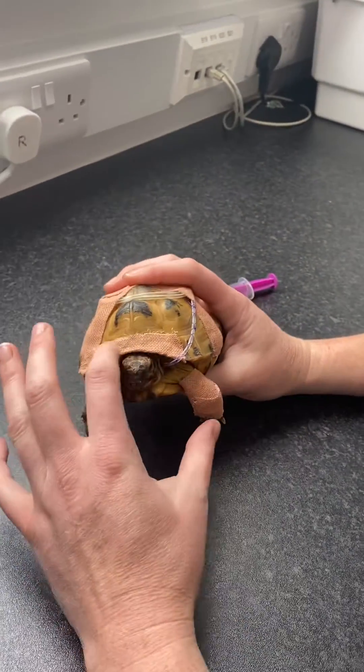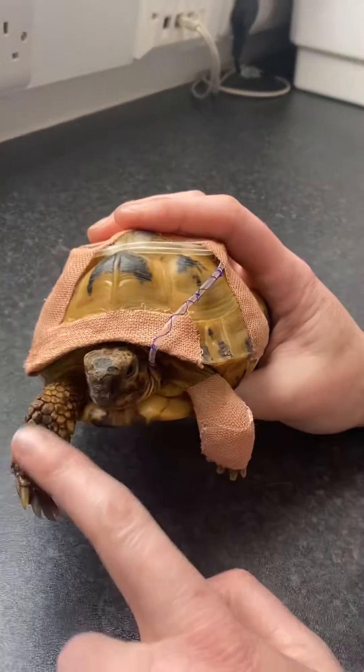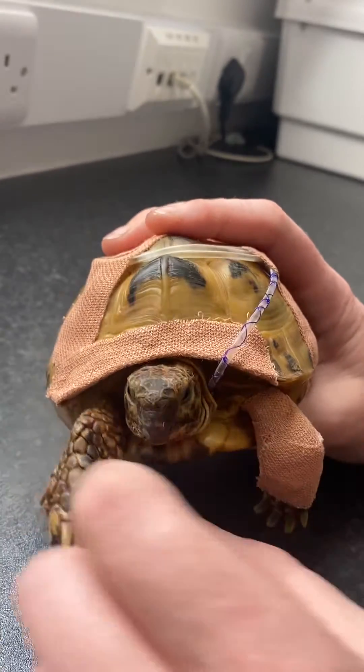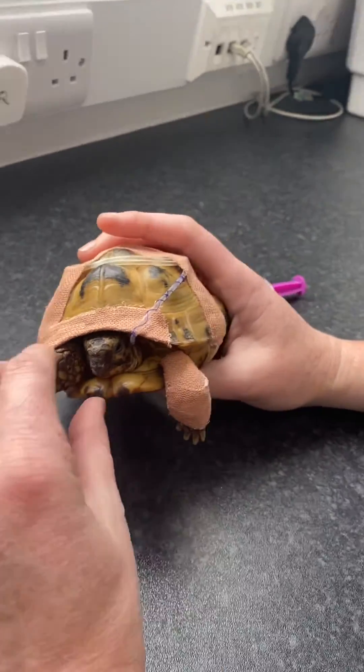We've protected the tube against the shell and the big scales on the legs. We've covered the one next to the tube so they can't hook the scales into the suture material on the tube and pull it straight out. We want to make sure that the tape stays in place, stays clean, and stays dry.